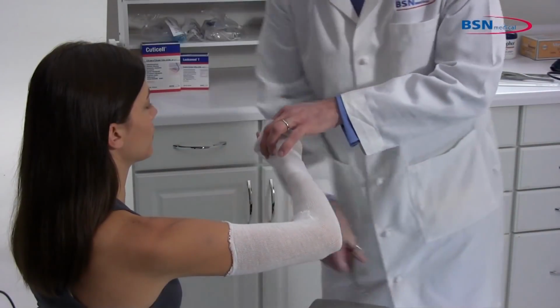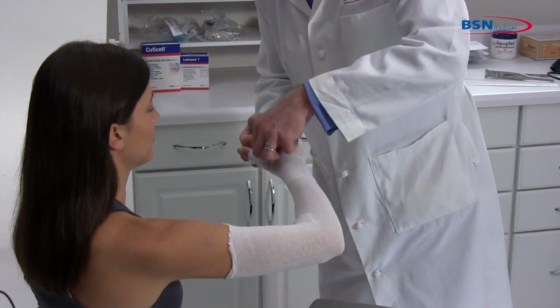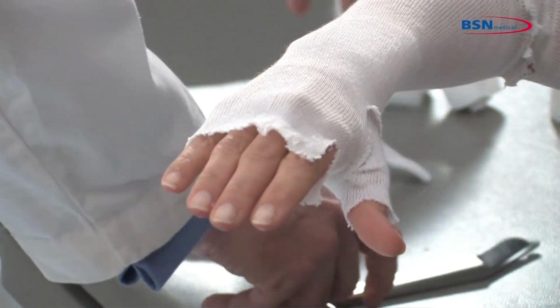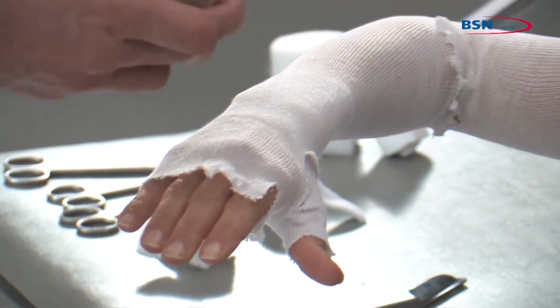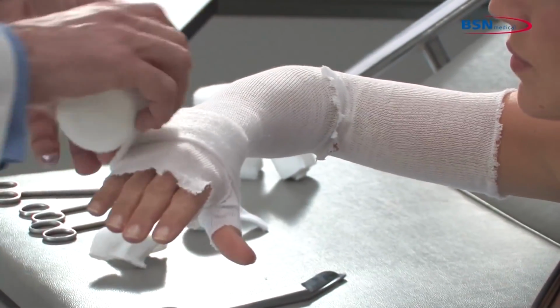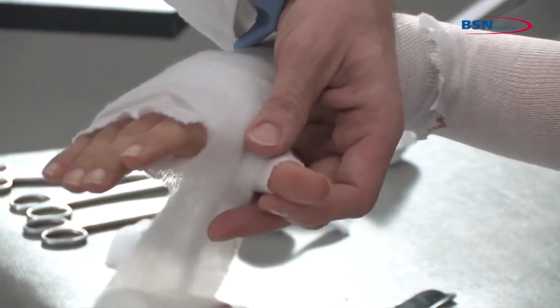Make a small cut in the stockinette for the thumb. Next, cut stockinette at distal thumb side for easy fold back. Using 2-inch or 3-inch padding and starting at the wrist, go through the web space and work toward the elbow, overlapping by 50%.